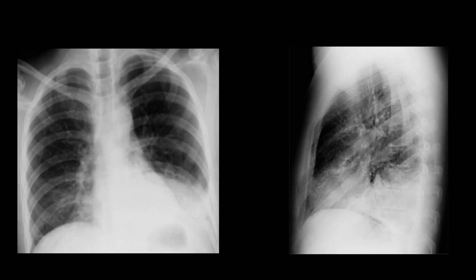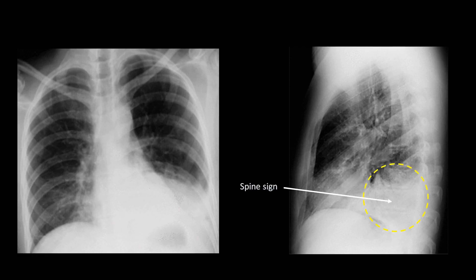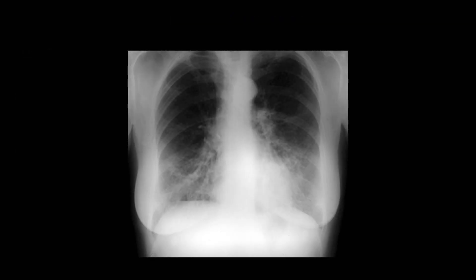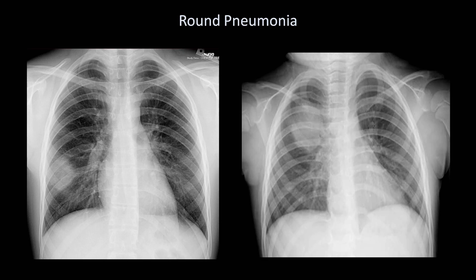In this next x-ray, there is a silhouette sign with the left diaphragm obscured. On the lateral film, there is opacification of the lower thoracic vertebrae — the spine sign — and therefore this is a left lower lobe lobar pneumonia. In another example, we see opacification in both lower lung zones. The opacifications are not as sharply defined, and there are no obvious air bronchograms — this is bronchopneumonia. Here are also two examples of the unusual round pneumonia, which can easily be mistaken for a lung mass and can only be distinguished on clinical history and resolution over days to weeks.